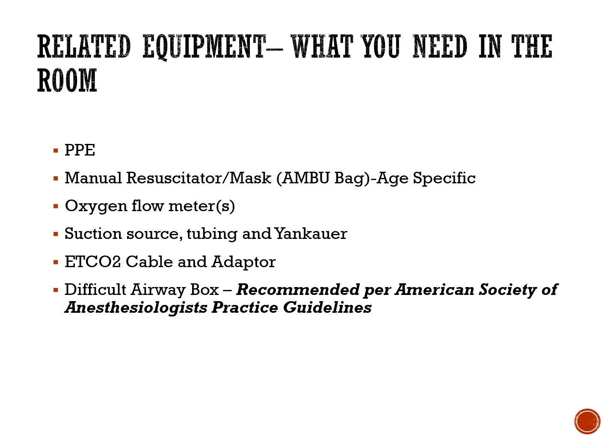So the end tidal with waveform, if your institution and the healthcare team has access to end tidal CO2 with waveform, that's pretty much the standard of care today. It not only is extremely useful in confirming placement, but it's also useful if there is a resuscitative effort going on. It can give some very important clues as to the quality of the compressions and the overall resuscitative effort.